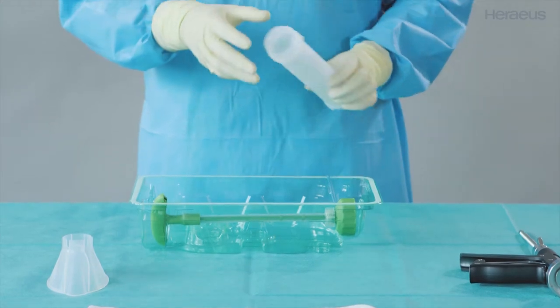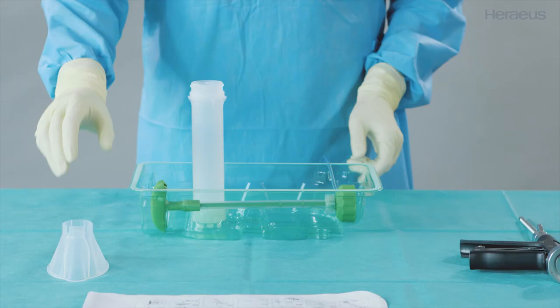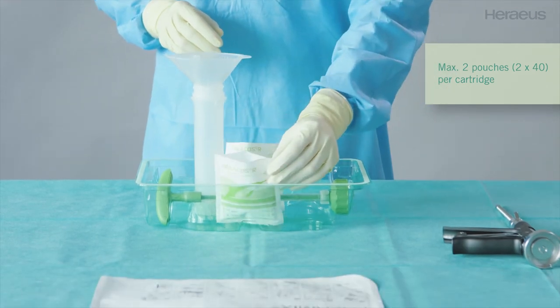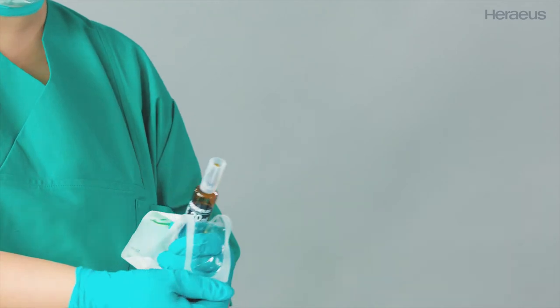Position the cartridge in tray station one. Put the funnel on the cartridge.